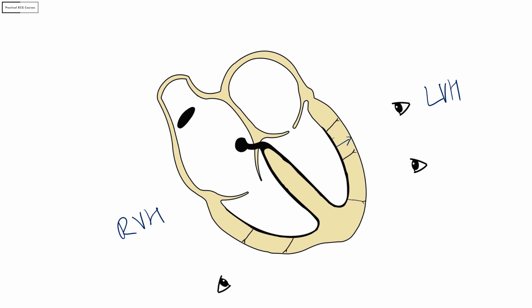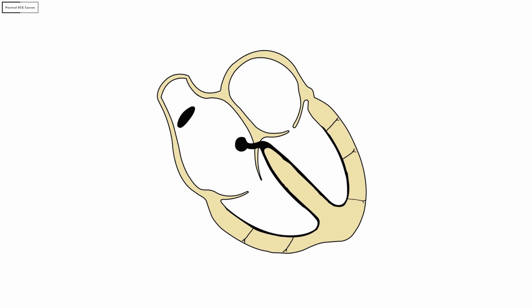Okay, now we have covered most of the concepts we need to make a diagnosis for our ECG. But since we have come so far, let me spend another couple of minutes and explain something else. If you have found this useful so far, you will definitely find the next bit useful as well.